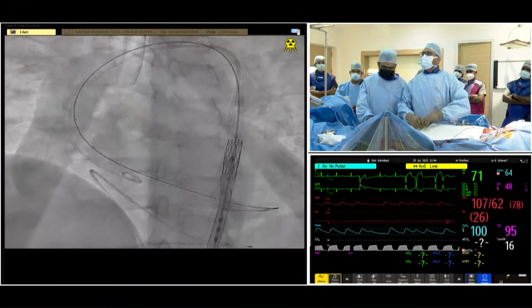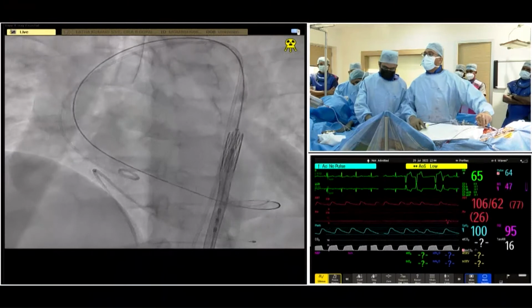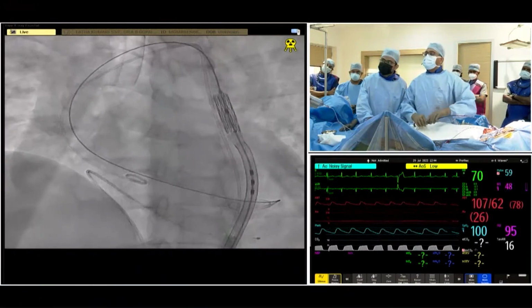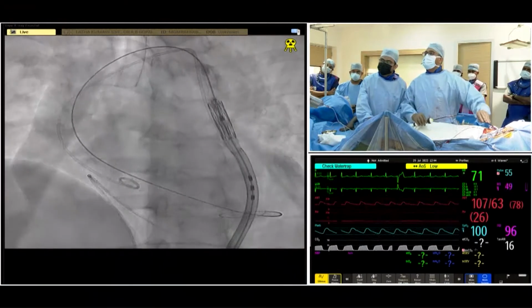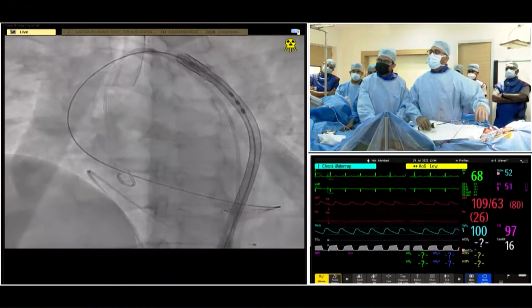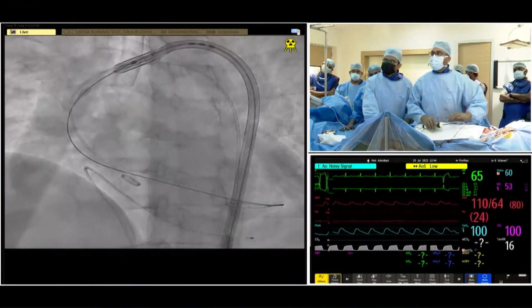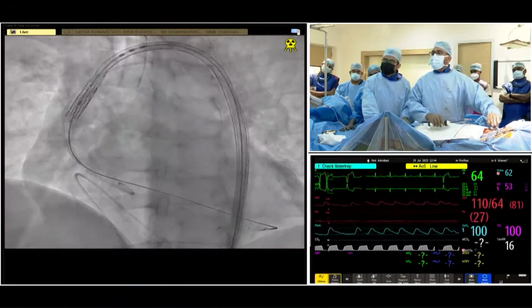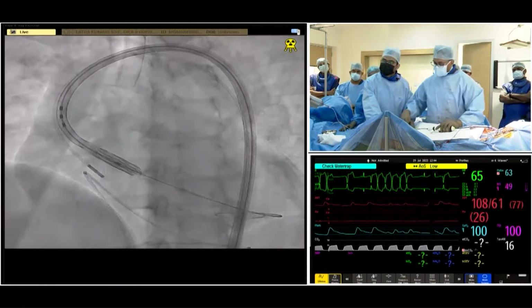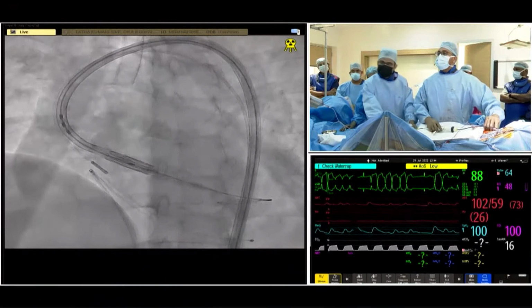Because with a bicuspid, I want good radial strength, and I want to be able to get a circular valve after the implant. This is very important for me. And I don't want to do pre-dilatations and post-dilatations if at all I can avoid. I want to minimize instrumentation to the aortic valve. And for all these reasons, balloon expandable has ticked the box for me for all these years. And that's the reason I'm choosing a balloon expandable valve.